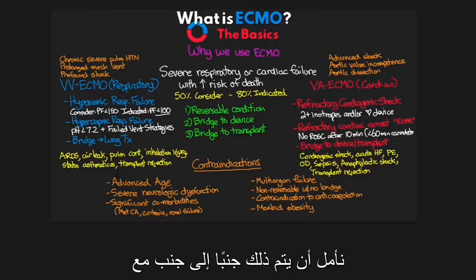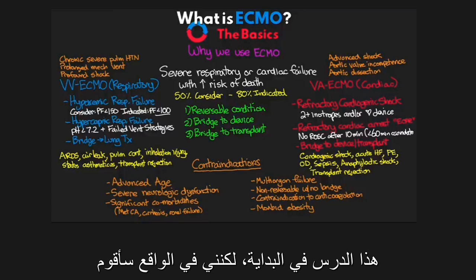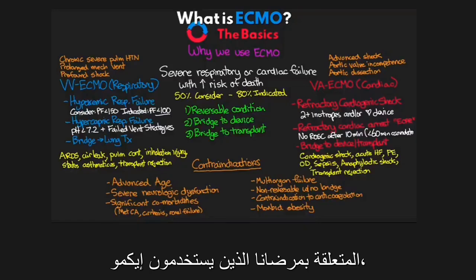Hopefully that, combined with talking through the circuit and the different configurations, makes sense. Why would we be using it? How would we be using it? And in what conditions would we find our patients that this would be potentially beneficial or would really prevent them from being able to get this therapy. I was initially going to include it in this lesson, but I'm actually going to make a separate lesson specifically looking at some of the basic physiology that's related to our patients on ECMO.